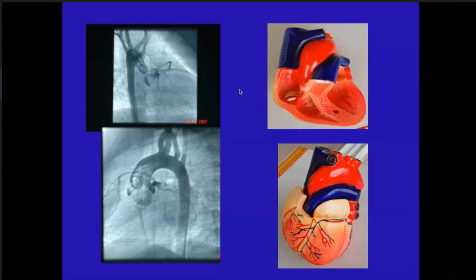Okay, both of them are wrong. Left, sir. Somebody else can try. Hey, come on. I've just showed you. This is an egg-shaped heart. The apex is cut off here. Heart is overlapping the spine. This is a typical RAO view and this is a typical LAO view. Heart, steep LAO view. Heart is overlapping the spine. The spine is on the left side of the heart. So this is RAO view, this is LAO view. Aortogram. It's actually a biplane of the same angiogram.